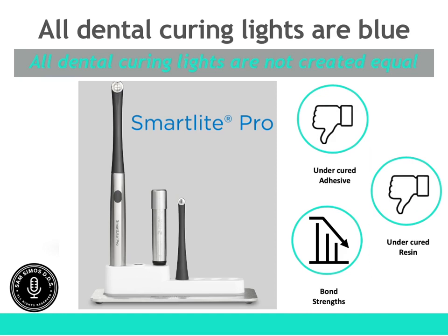So no manufacturer recommends undercuring resin or undercuring adhesive. Every manufacturer recommends a complete cure of your resin and adhesive. And so this is where I just wanted to deviate a little bit and let you know that curing lights are a big deal. There's so much written about curing lights, and we won't go into that in this lecture, but I do want to emphasize that a curing light is a big part of the success of your adhesive.